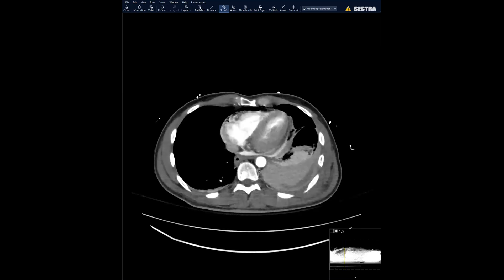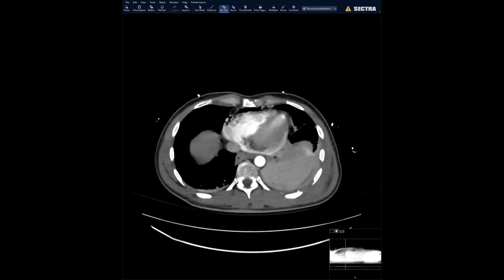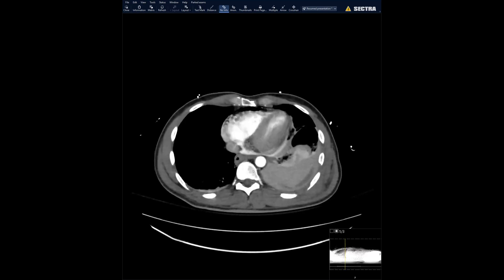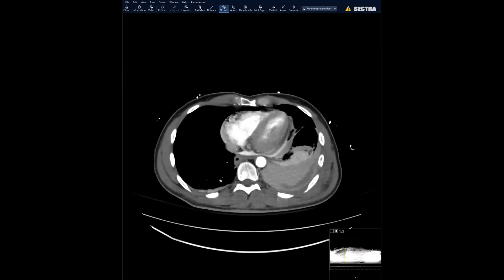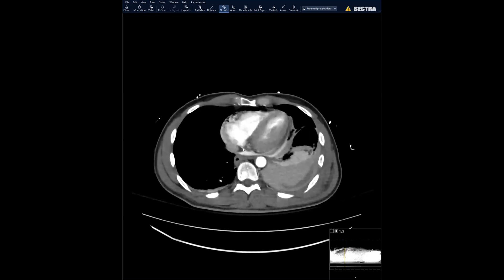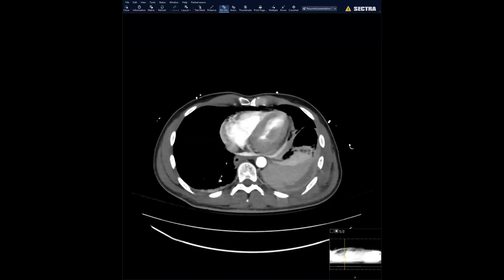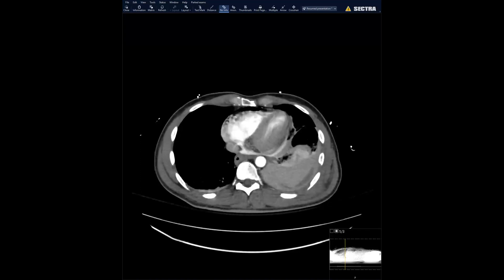I'll show you the venous phase. Do you see the little defect here? So this was a big tear at the junction of the IVC and the right atrium. It was a shear injury — they found a three centimeter tear of the posterior wall of the right atrium. This was a contained right atrial rupture.